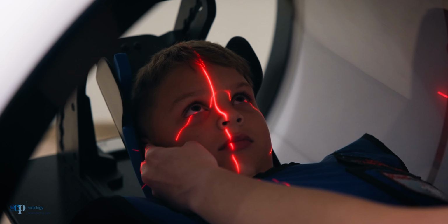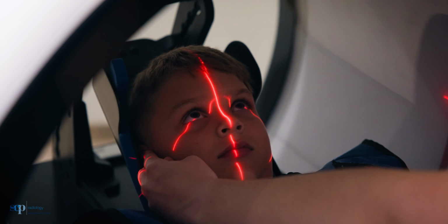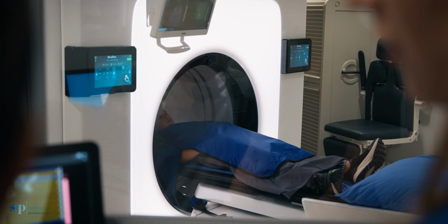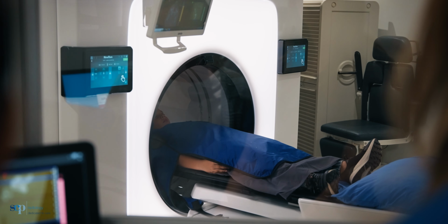Most of our scans are focused on the sinuses, the inner ears, as well as the mandibular area, which is focusing on the teeth. For the preoperative planning of cochlear implants, we do have specific positioning of our patients, which enables the referring physician to do their preoperative planning correctly.